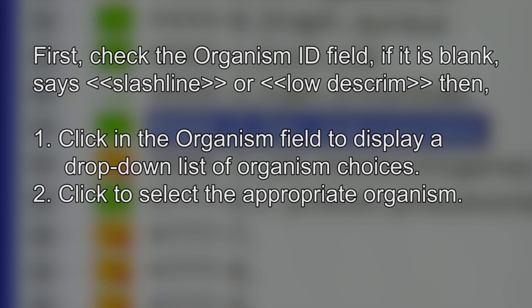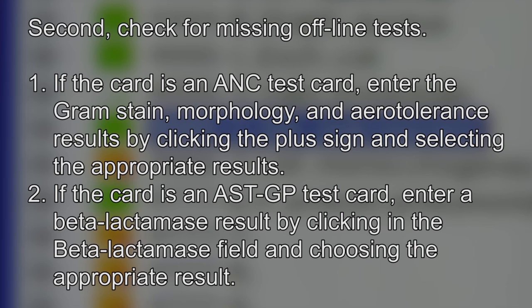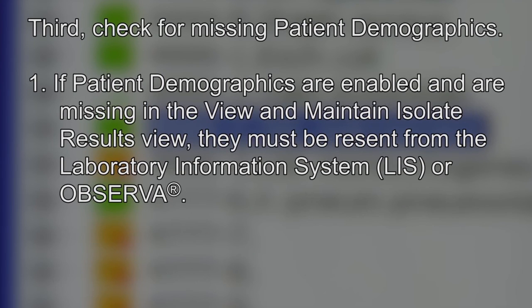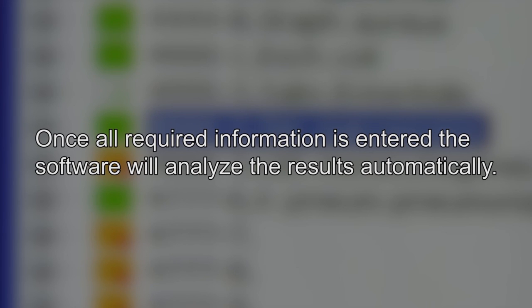In summary, qualified isolates are missing required information. In order to resolve qualified isolates, the required information must be entered. First, check the Organism ID field — if it's blank, says Slash Line, or says Low Discrim, click in the organism field to display a drop-down list of organism choices and click to select the appropriate organism. Second, check for missing offline tests. If the card is an ANC test card, enter the gram stain, morphology, and aerotolerance results by clicking the plus sign and selecting the appropriate results. If the card is an AST GP card, enter the beta-lactamase result by clicking in the beta-lactamase field and choosing the appropriate result. Third, check for missing patient demographics — if patient demographics are enabled and are missing, they must be resent from the LIS or Observa. Once all required information is entered, the software will analyze the results automatically.